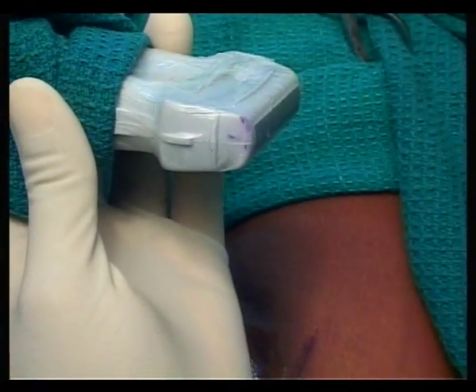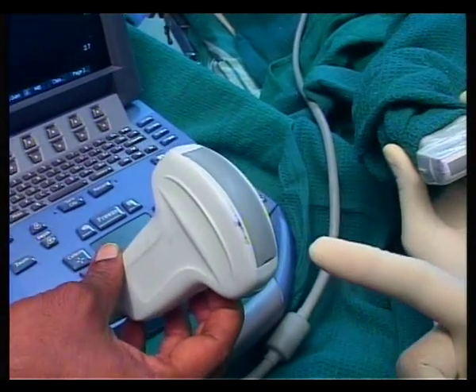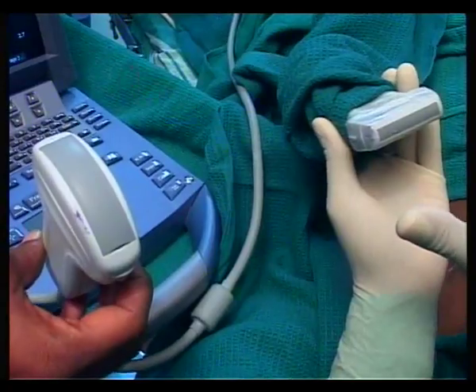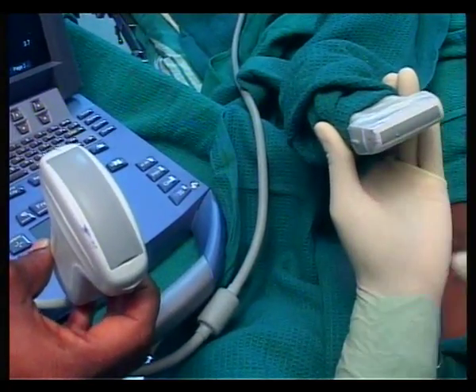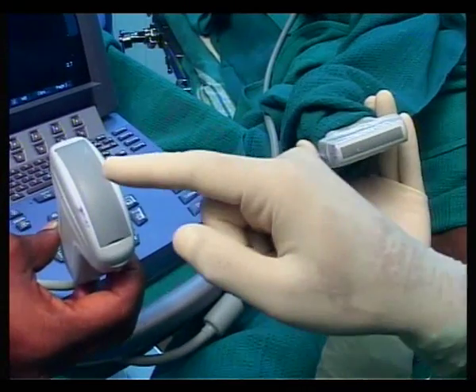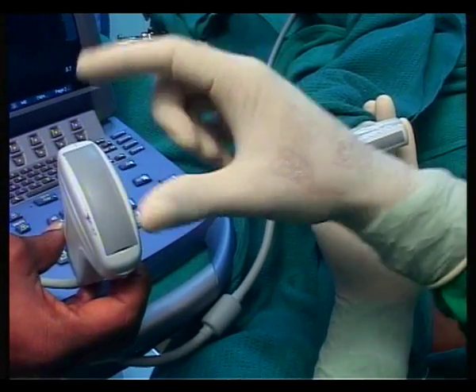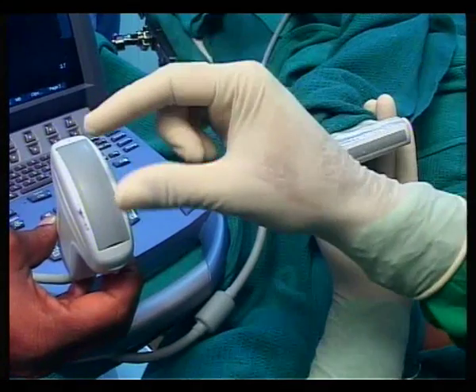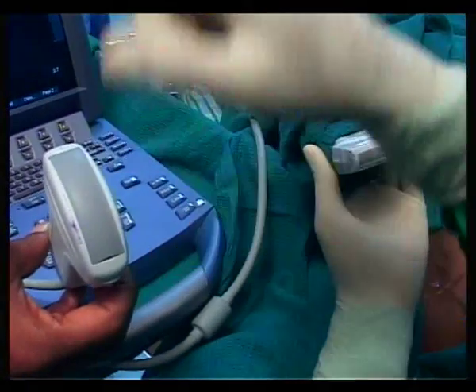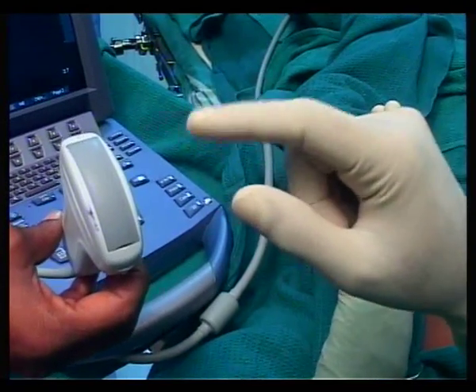The other type is the curvilinear or curved array probe. The difference is that the linear probe produces a wide, parallel sector image across its entire footprint, whereas the curved probe produces a narrowed sector in the central region that diverges outward at an angle — so the sector is narrower at the top but fans out.